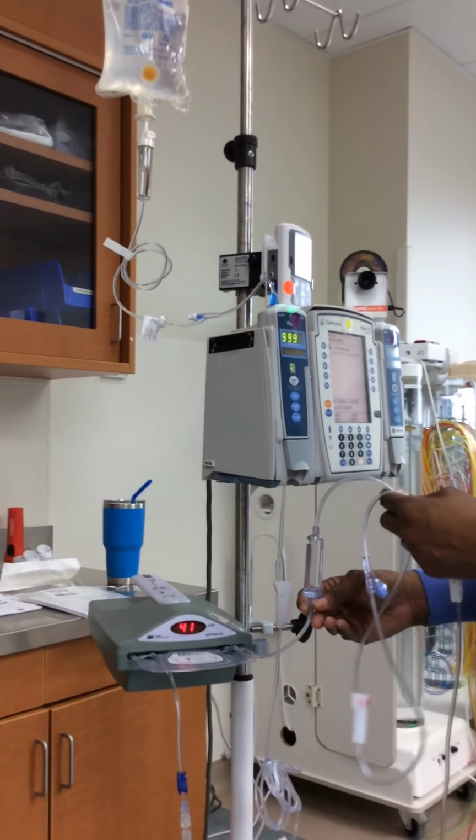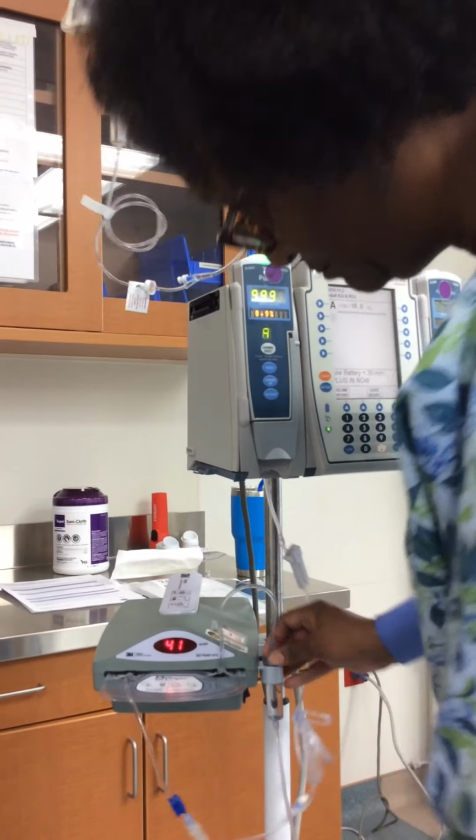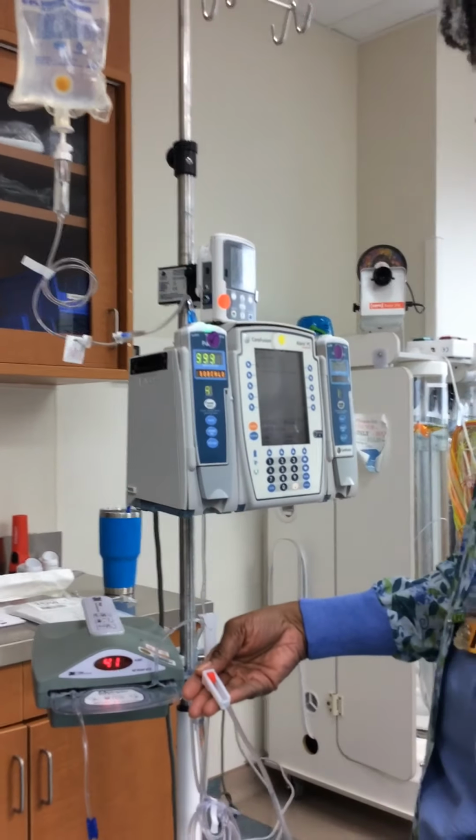So once the chamber is filled, she's going to go ahead and flip it over and put it into the chamber holder right there next to the cassette. And then you can go ahead and continue to prime down to the end.